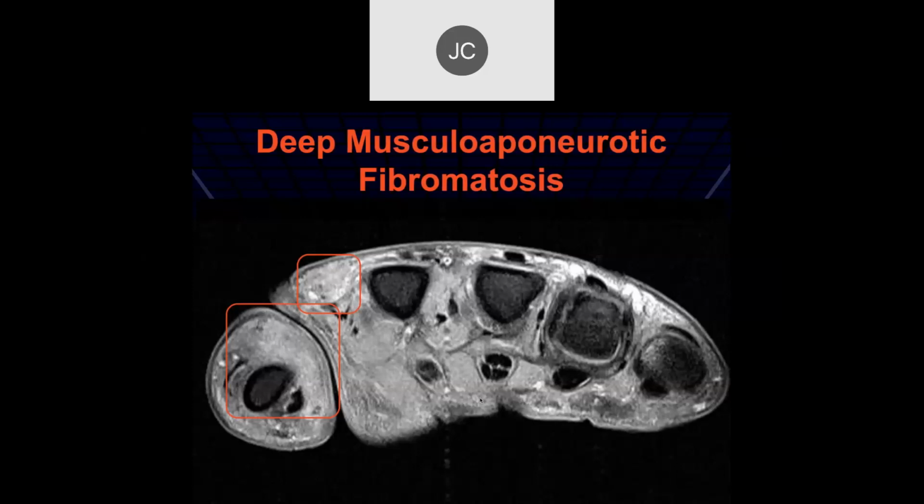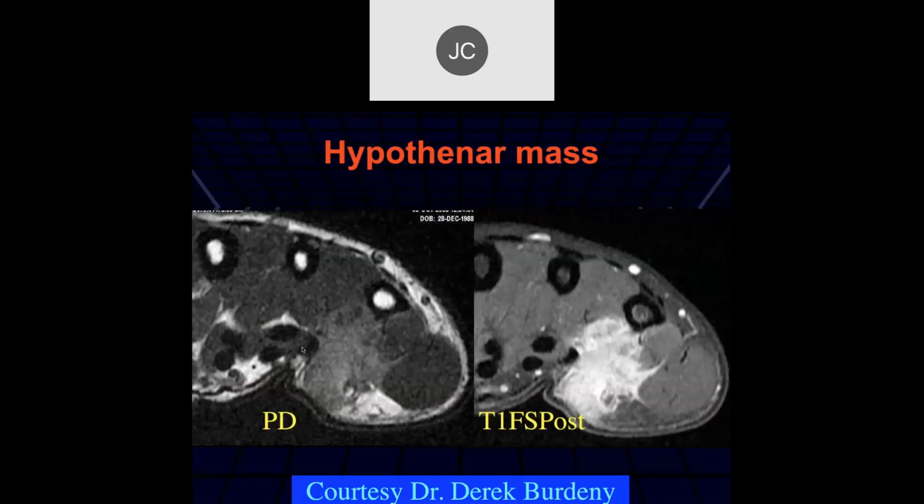The Dupuytren's is typically volar to the flexor tendons, but you can get fibrous depositions in other soft tissues too, typically in the hands. A lot of these may also be due to trauma in people who work a lot. Okay, Tayson.